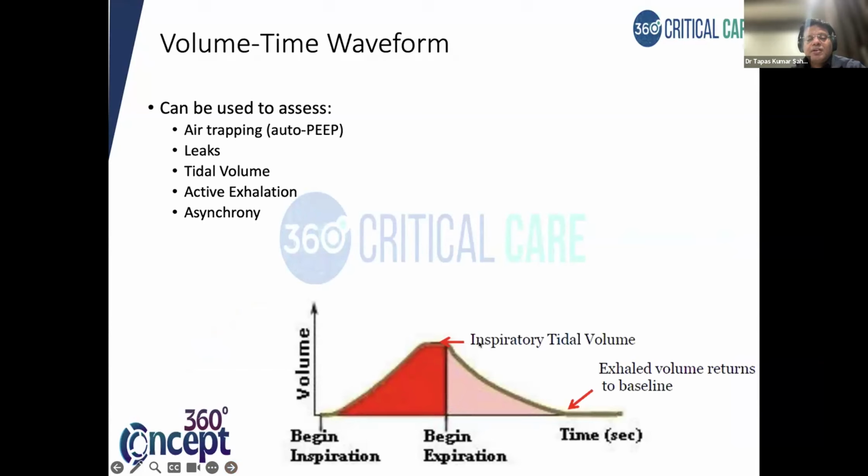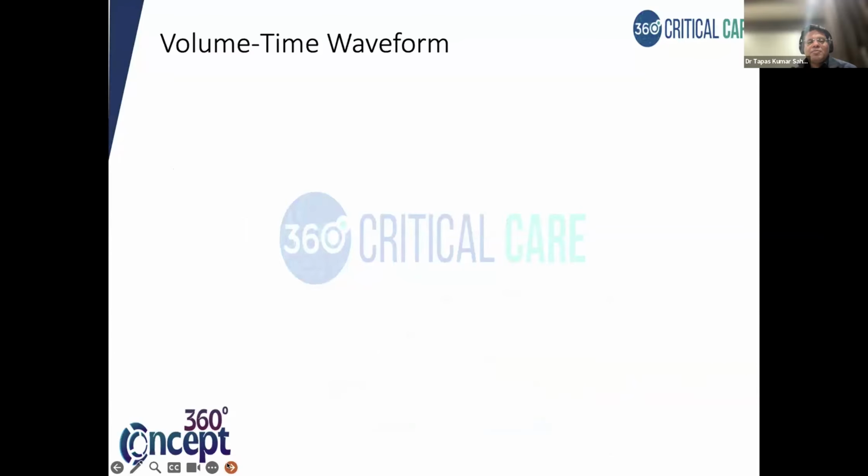Now you can see the inspired tidal volume is the maximum here. You are inspiring here, reaching here. This is the maximum inspired tidal volume. Now here you are beginning the expiration and the expired volume is now returning to the baseline. So this is the volume time waveform.